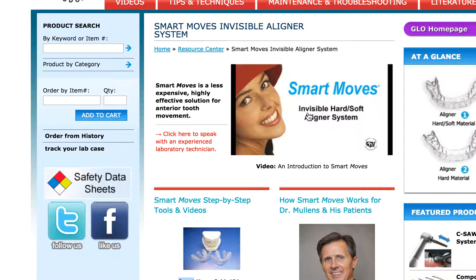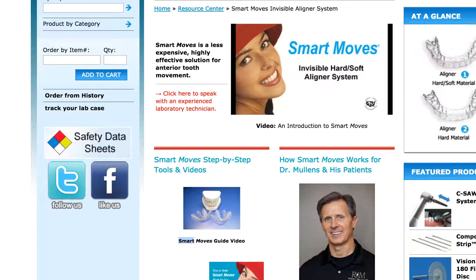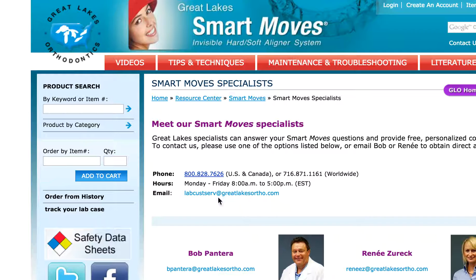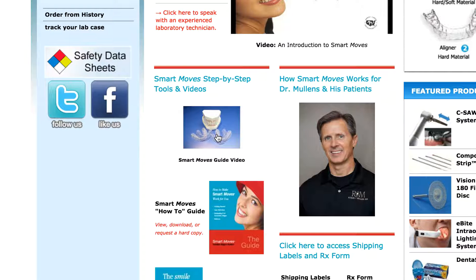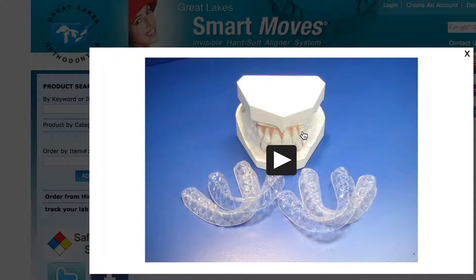A couple of things I really like about this system — good job to Great Lakes — you can click here to speak with an experienced laboratory technician. They give you the phone number, the hours, and the email. I emailed them earlier today and I'll let you know when I hear back. It's nice that they have that resource available; I've never seen it on anyone else's. They also have how-to videos explaining the process. It is a bit simplistic — this is not digital technology. It's simple hands-on: saw, cut, wax-up, and they even send back the wax-up to show your patient.